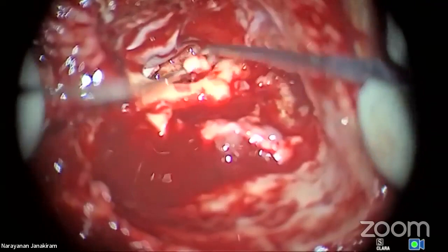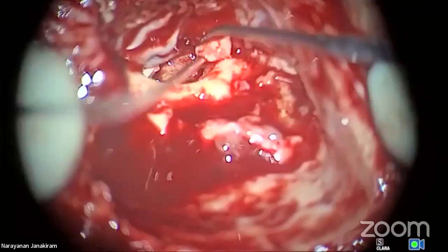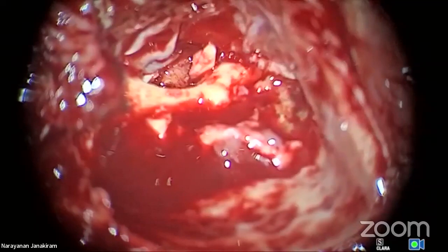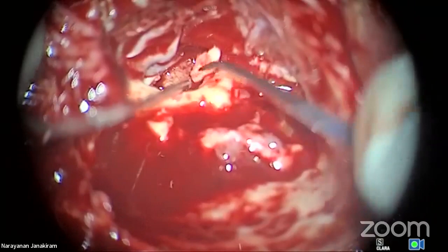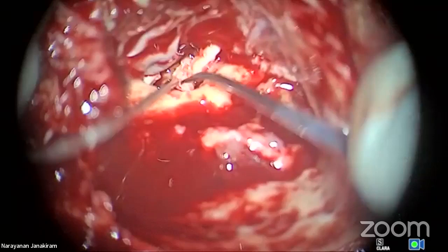Now you see here. Suction. So that's for the stapes. Good, good. Now see that I'm placing that cartilage like a type 3. Can you see that clearly now? It's clearly standing there. I'm going to stabilize that with gel foam and another cartilage. Just keep this cartilage for stability.